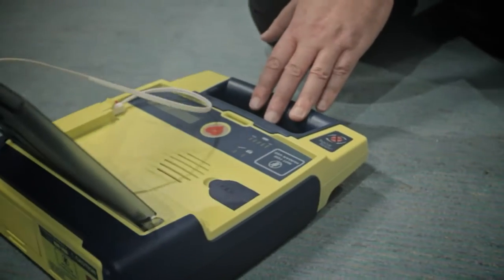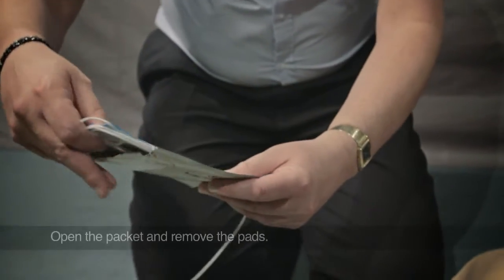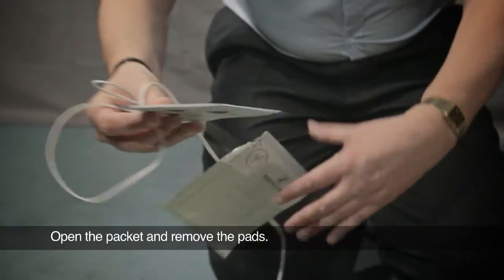All I'm going to show in this demonstration is just where the two pads go on the person's chest. To operate it, we'd open the lid first, then it's going to tell you some way to tear open the packet and to remove the pads.